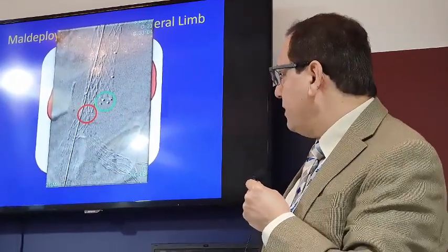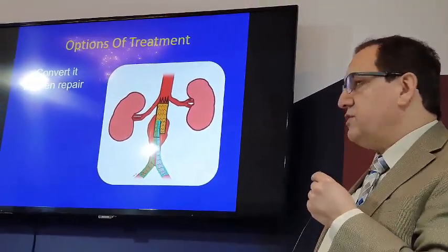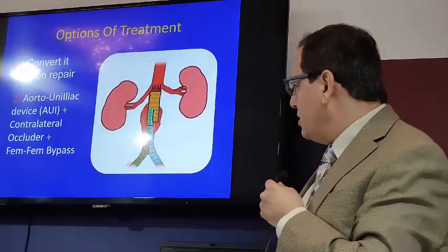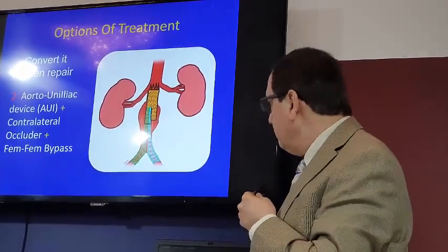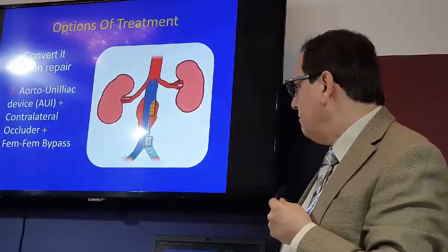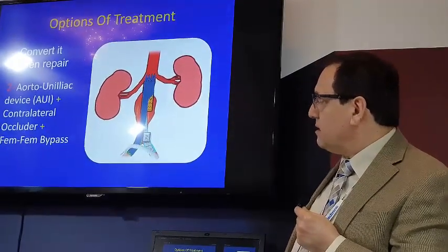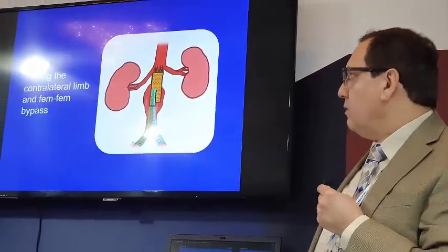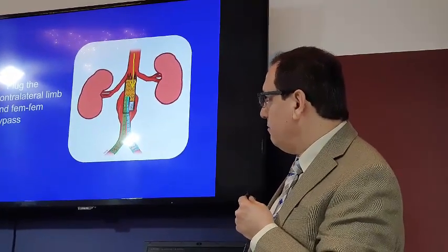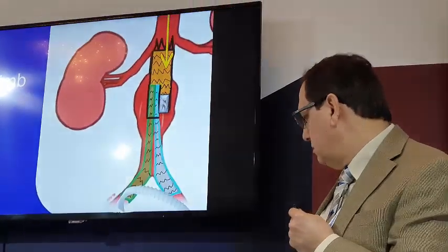So how do we deal with this one? You have many options. I'll give you a couple options if you get this problem. First, you can convert to open. You still have open surgery. Another option, just convert to aorto-uni-iliac. Put an aorto-uni-iliac here, and then do a fem-fem bypass. Put a block here so you don't get retrograde flow, and do the fem-fem bypass. This is option number 2. We have option number 3. Just come from above, put a block here, and do just a fem-fem bypass.